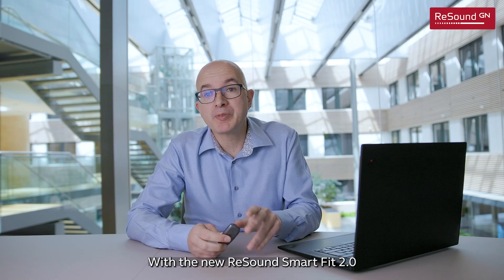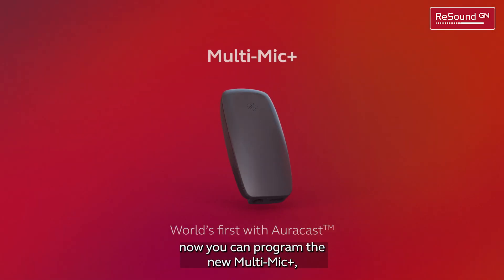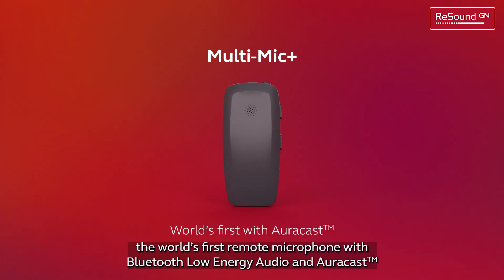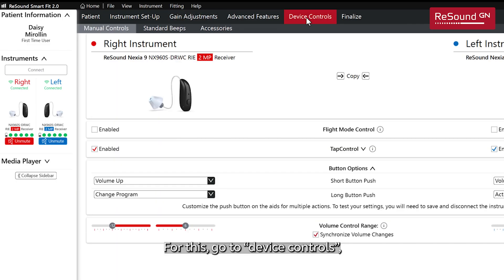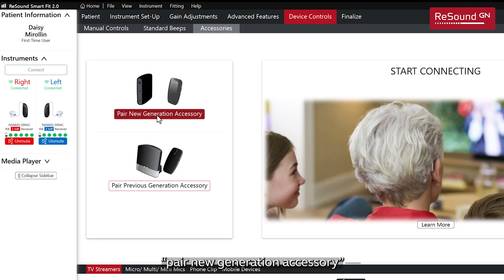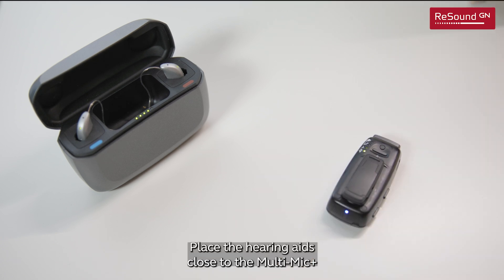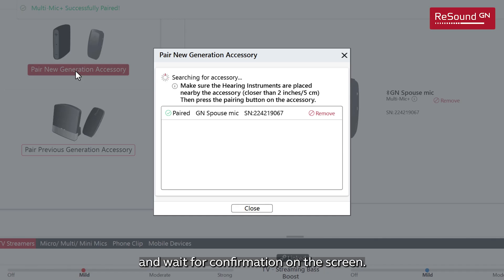With the new ReSound Smart Fit 2.0, you can now program the new MultiMic Plus — the world's first remote microphone with Bluetooth Low Energy Audio and AutoCast. For this, go to Device Controls, then Accessories, then Pair New Generation Accessory. Press the pairing button, place the hearing aids close to the MultiMic, and wait for confirmation on the screen.